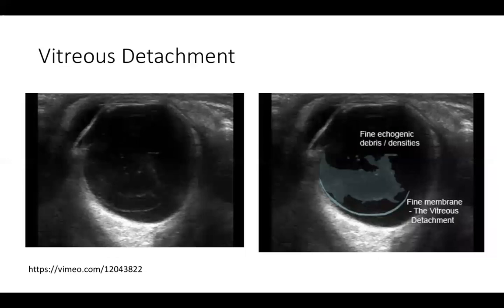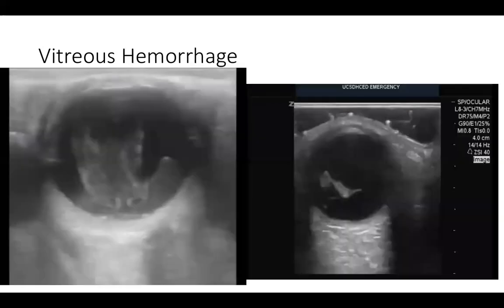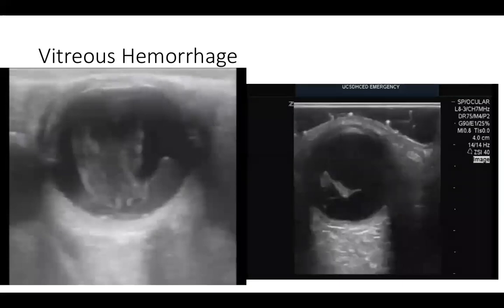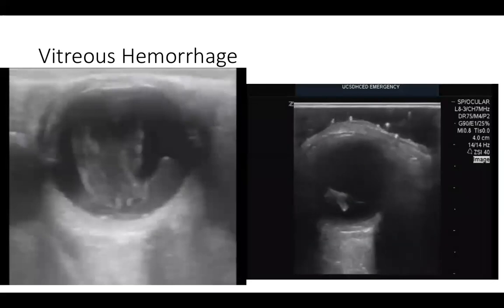Next we would look for a vitreous detachment. You can clearly tell this looks quite different — there's a bunch of echoes within that posterior chamber. Normal posterior chambers should be completely anechoic, but here you're seeing multiple different echoes consistent with vitreous detachment or vitreous hemorrhage. Many people call this a 'washing machine sign' because it looks like something is swirling within that posterior chamber — like clothes swirling inside a washing machine.